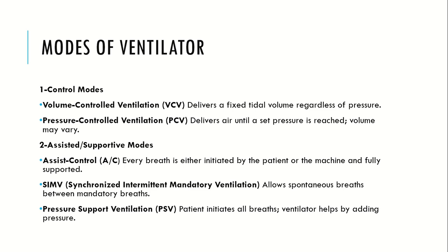So here are the modes of ventilators. There are control modes like VCV, which delivers a fixed tidal volume regardless of pressure, and PCV, which delivers air until a set pressure is reached, and the volume may vary here.